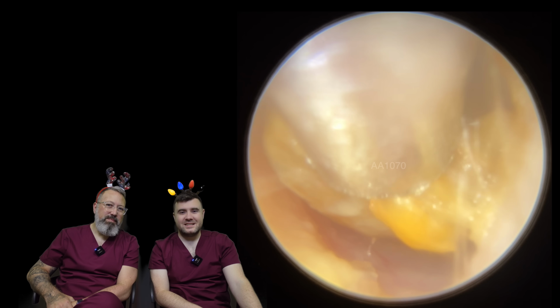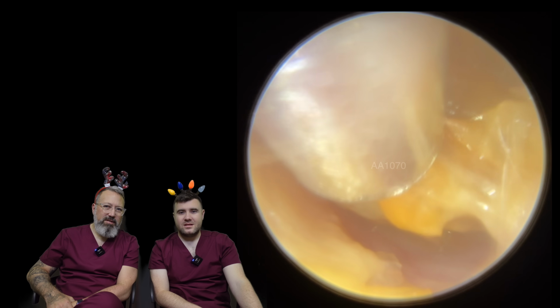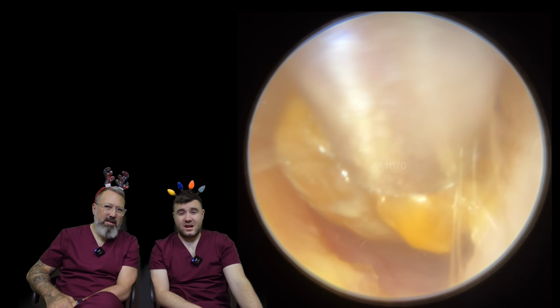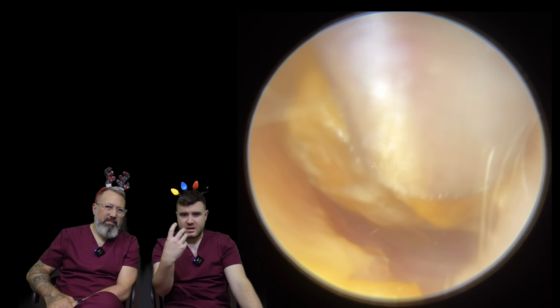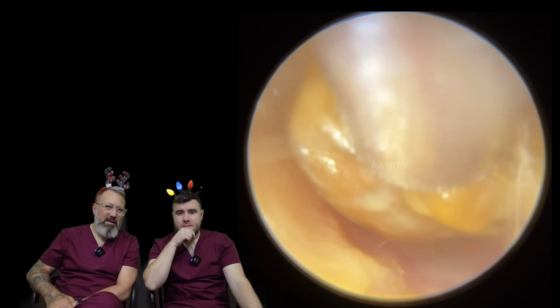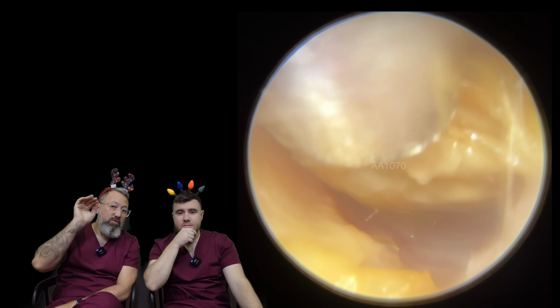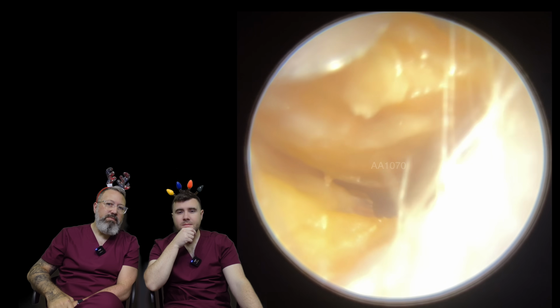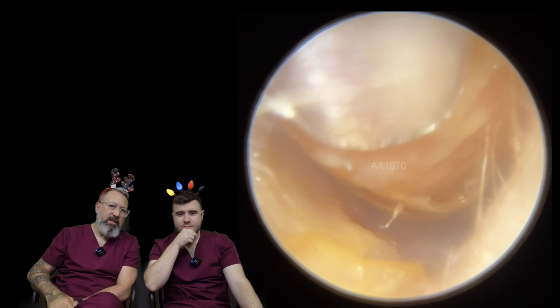Yeah, it does look like it's just peeled along. All that front section's peeled down. It looks like it's all coming away nicely. It's starting to, very, very slowly. I think this was quite a deep set wax as well. It depends how far back that skin goes, doesn't it? Because if that skin goes most of the way down the ear canal, as much as you lift this front end, you'll always have that back end of it that's going to hold on really tightly.